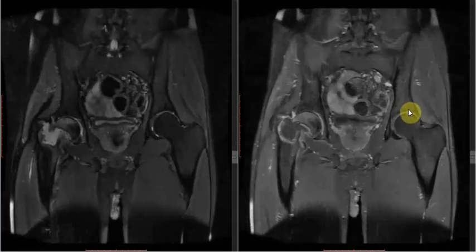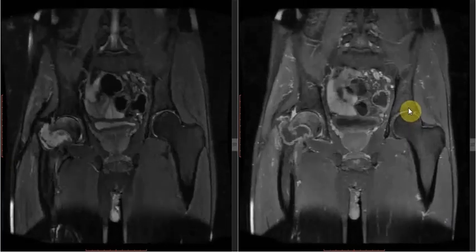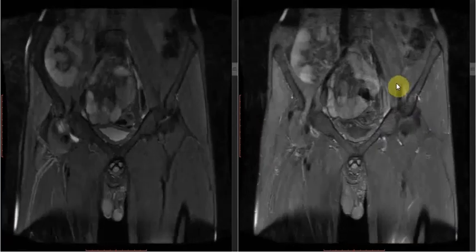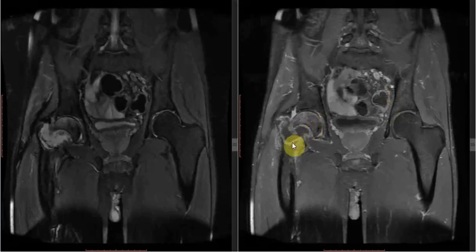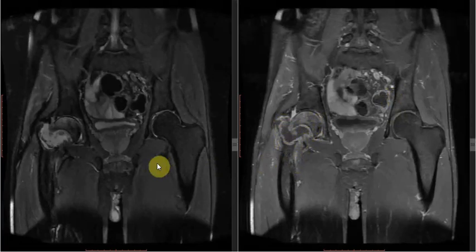On the coronal T1-weighted post-contrast sequence, we can see there is no evidence of any solid enhancing lesion surrounding this, and there is only mild enhancement of the lining in the cavity. So this is the case of a benign osteolytic lesion, most likely a simple bone cyst involving the neck of femur, which had led to the pathological fracture in this area.